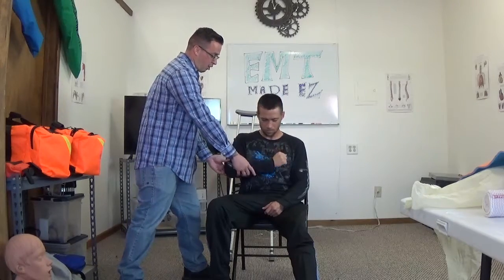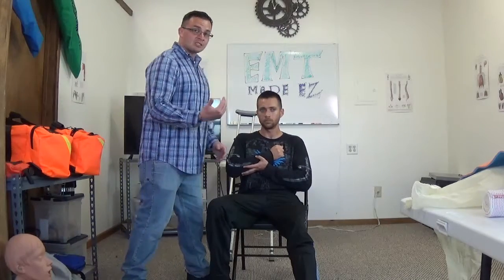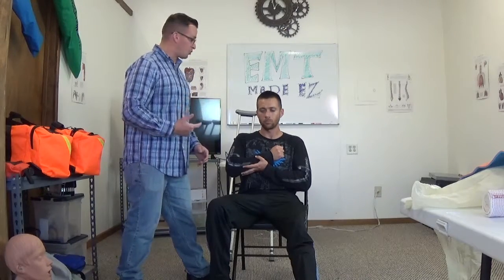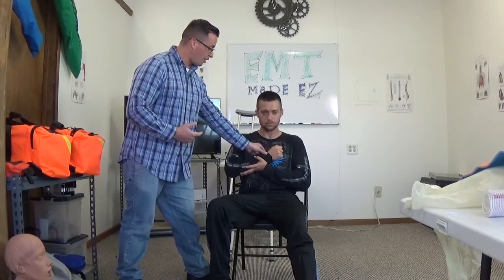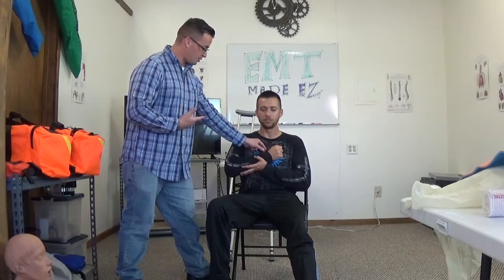Go ahead and get that arm and rest it up. Next I'm going to check for CMS — circulation, motor, and sensory. I'm going to check for a pulse and ask the proctor: is my pulse present? CMS is present.